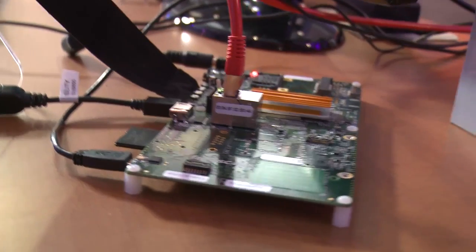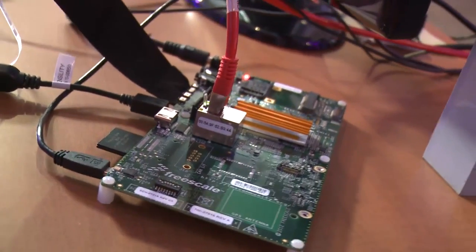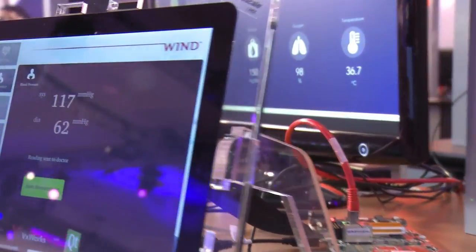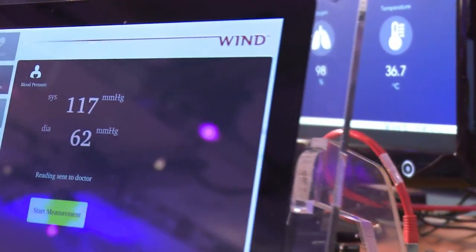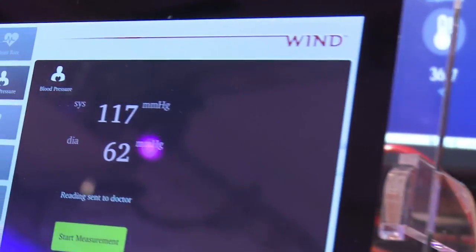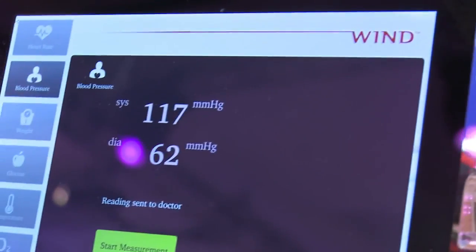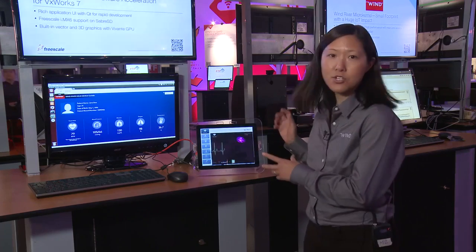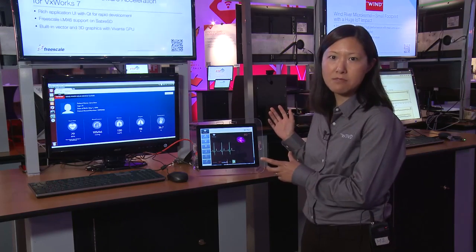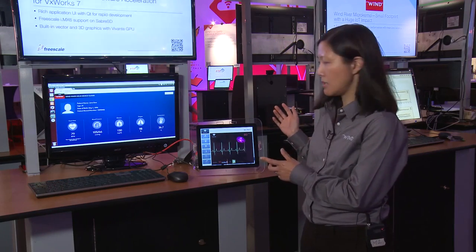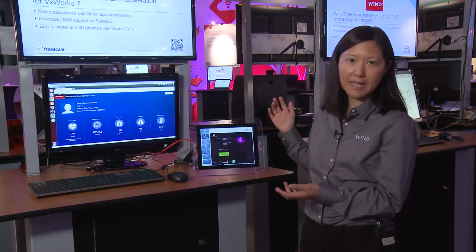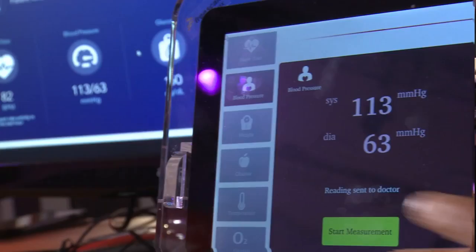This is a Sabre SD board, and in this example, this is a home health care system. So if I'm at home and I'm a patient, I can use this device to monitor my heartbeat, my pulse, or I can be at home and take my blood pressure.